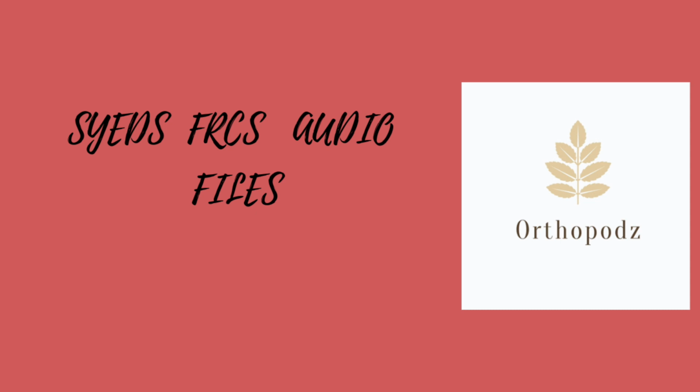Standard plates rely on friction between the plate and the bone. Broad DCP has advantages because there are multiplanar screws. LCDCP has the advantage that periosteal blood flow is not compromised.